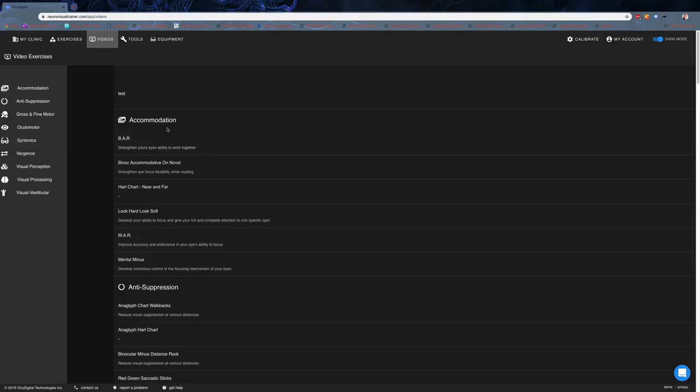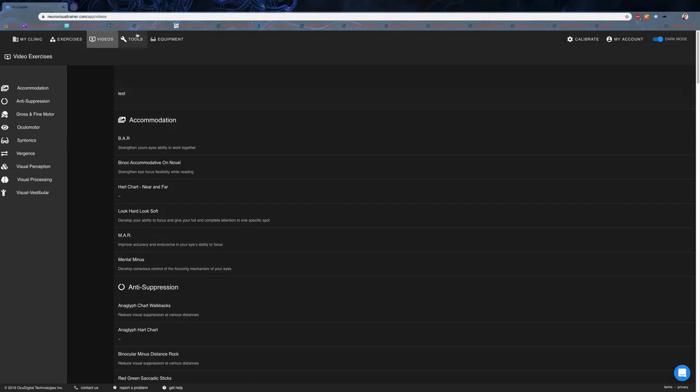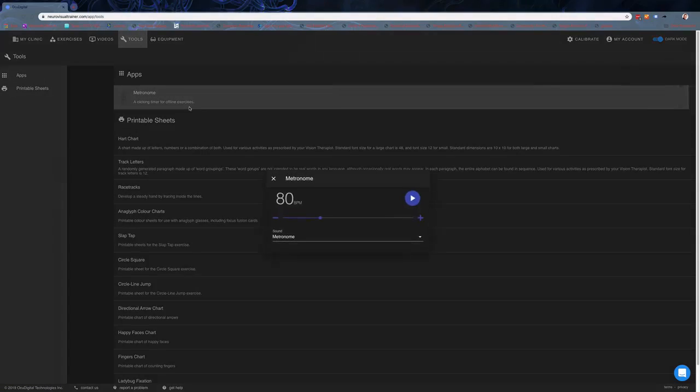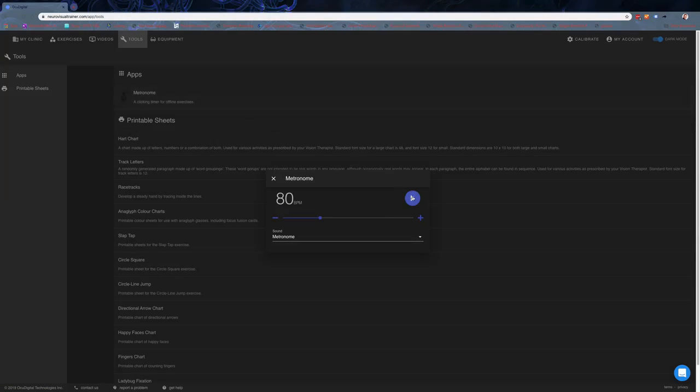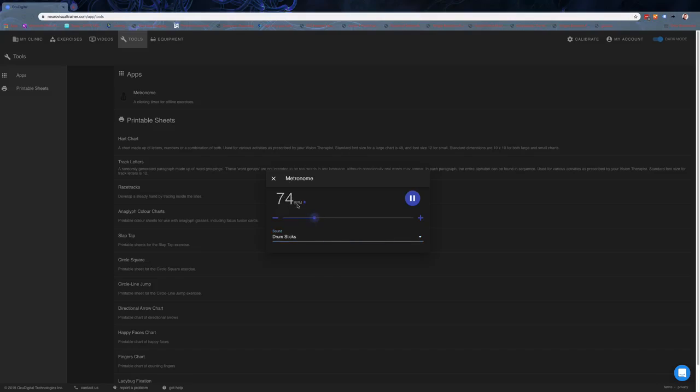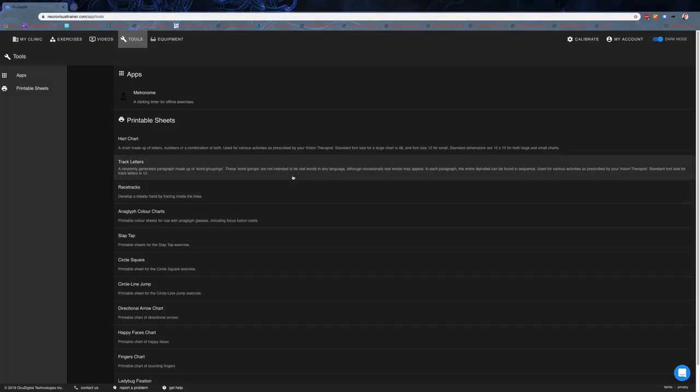Speaking of the metronome, if we dive over into tools, you can actually see there is a metronome app that anybody can use. You can change the sound for those who don't like certain sounds, and you can change the speed. So the interactive metronome app is super handy.